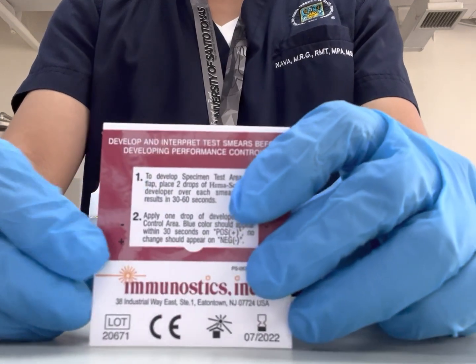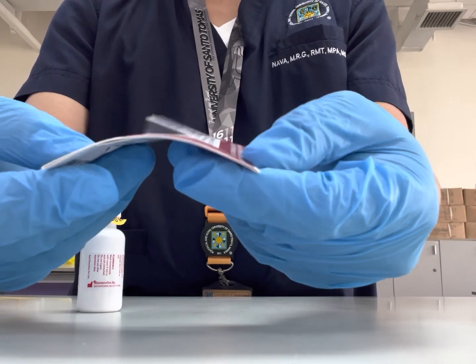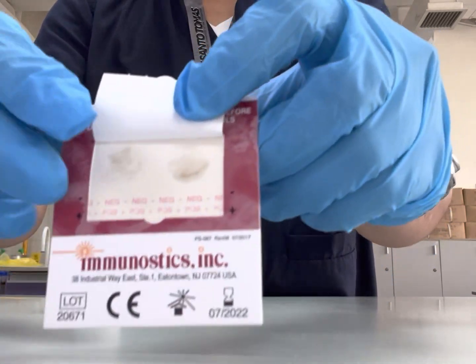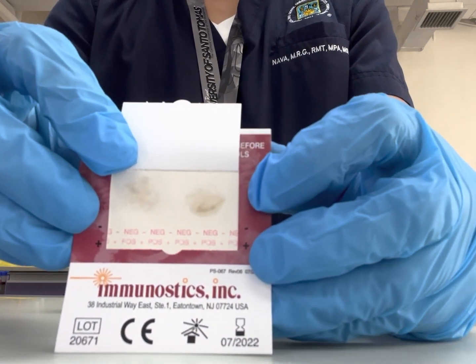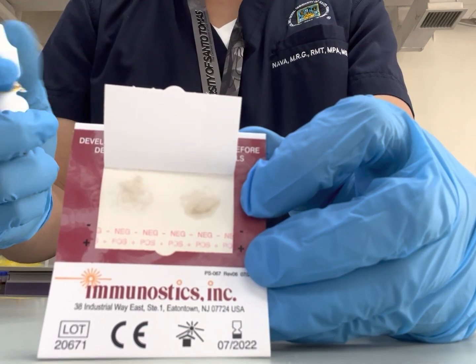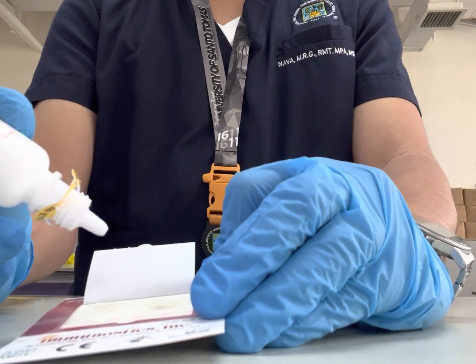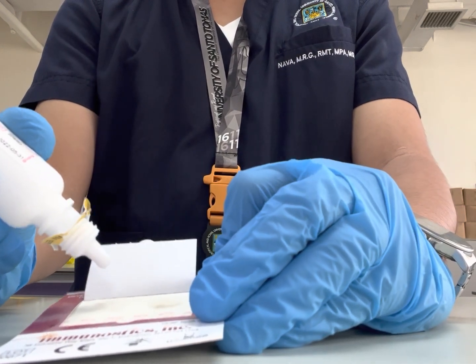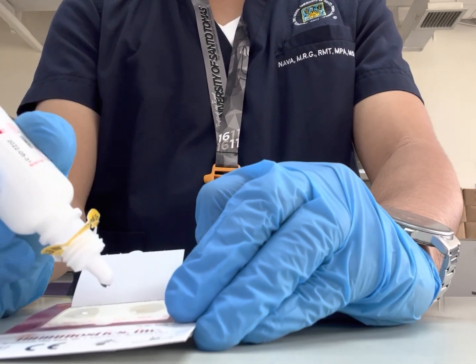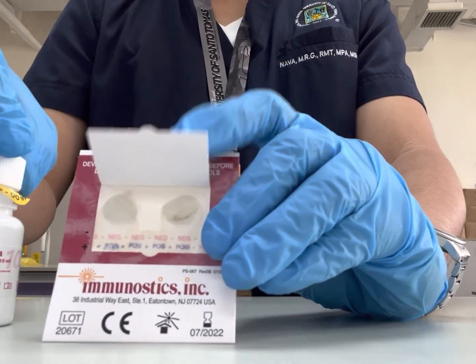In the actual setup, make sure to label with the patient's information. At the back side of the test card, open by gently bending the test card to reveal the testing area. Add one drop of developing solution on each of the smears, then add another drop on the lower portion, or the control area.